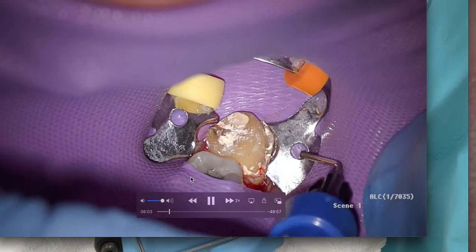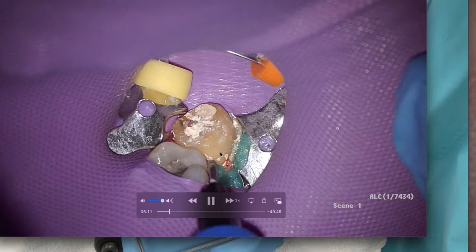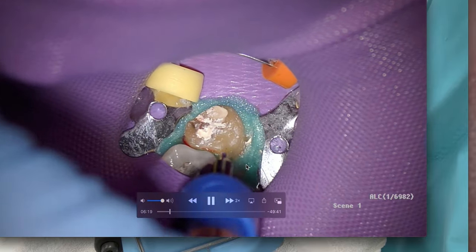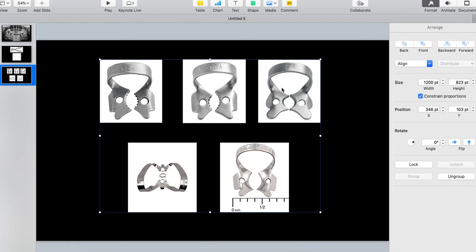Ideally I should have re-punched the rubber dam because it got stretched out, but we were sealed up and good to go. So the 2a is very useful for premolars and situations like this post-crown-removal access. We also talked about the 210 or the 9 clamp.